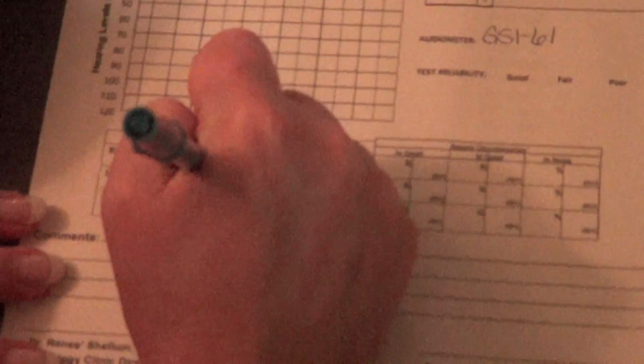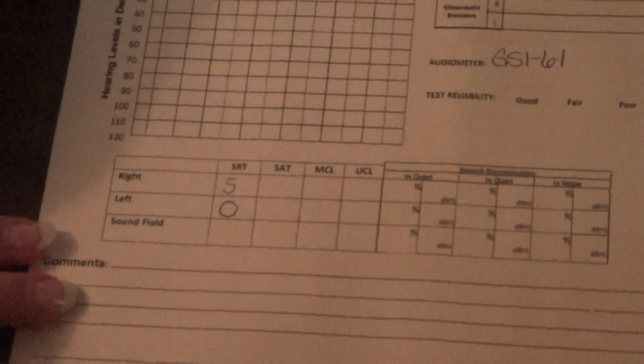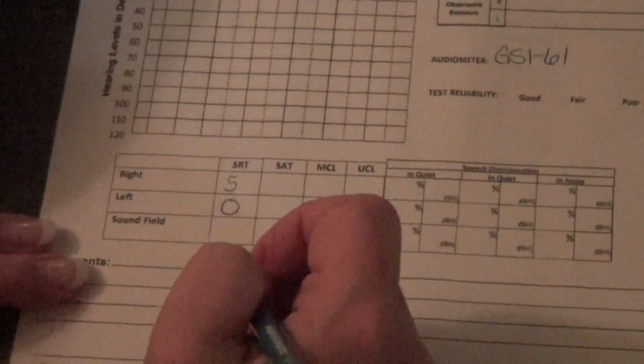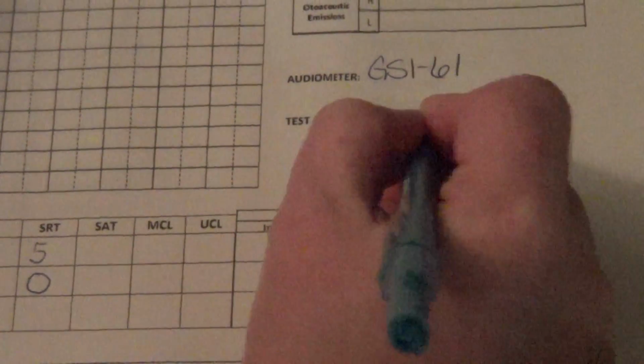Okay, so for her left ear, her threshold is at 0 dBHL. Again, in great correlation with the pure tone average. So therefore, I can go up to my audiogram and mark good reliability.